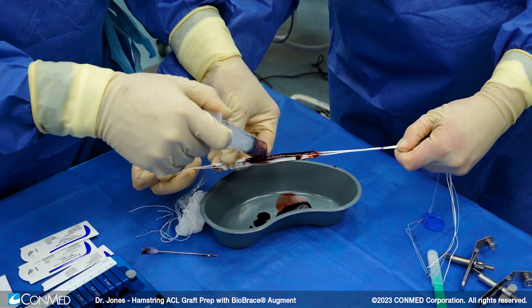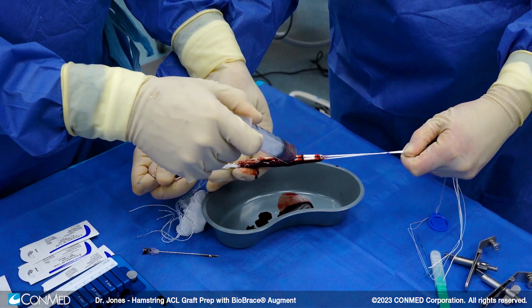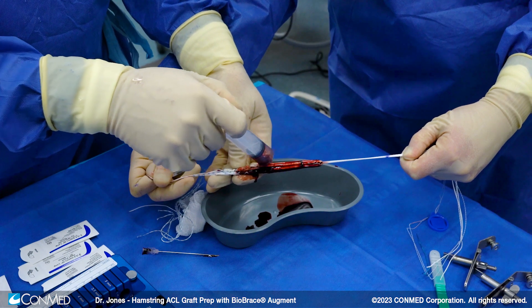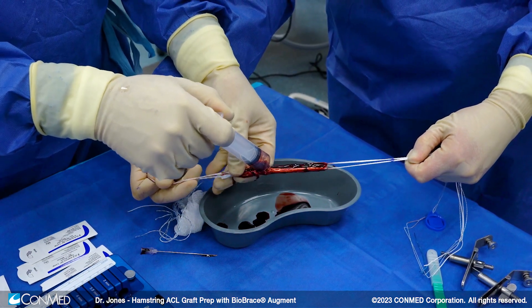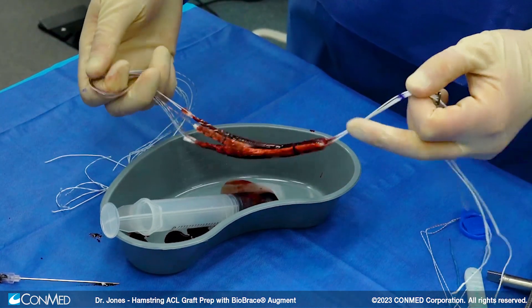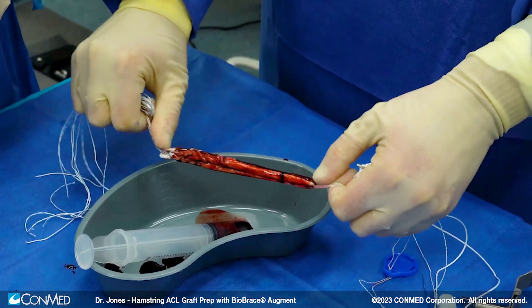I'll go between and get the allograft as well. I usually do this at the end — the graft has been tensioned appropriately, we've gotten rid of the creep, we're ready to pass it. So we put the blood on immediately prior to passage of the graft. There you can see we have now soaked our biobrace in the patient's blood, and the healing process has already begun.